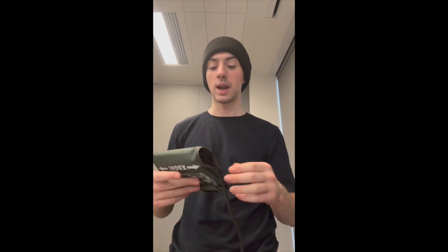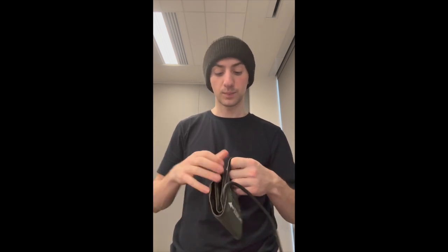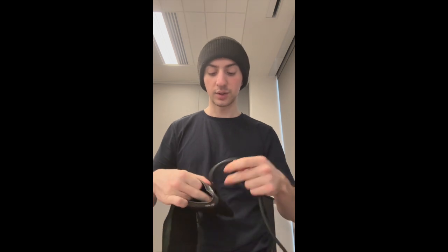So the way that the sleeve works is it's going to be pumping air in, and there's a little sensory part right in here where this tube is, which is actually going to measure your blood pulse.